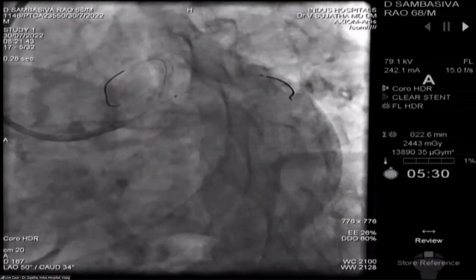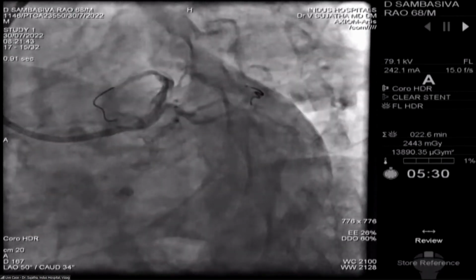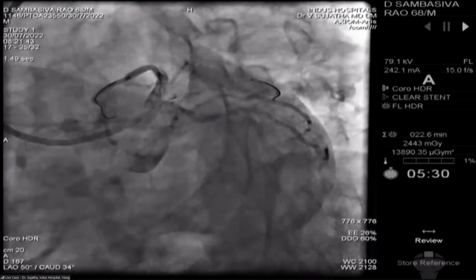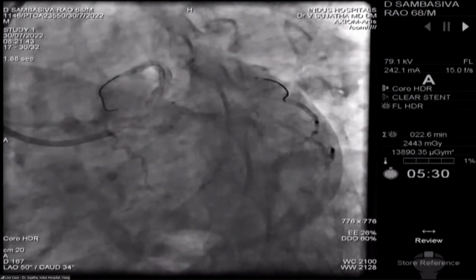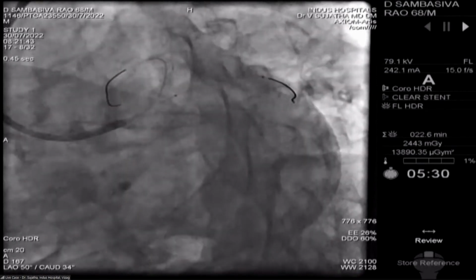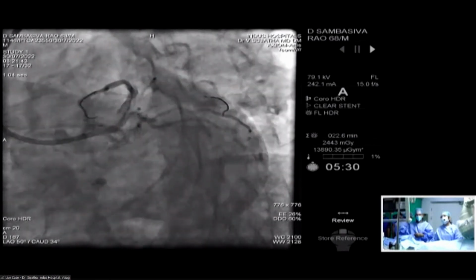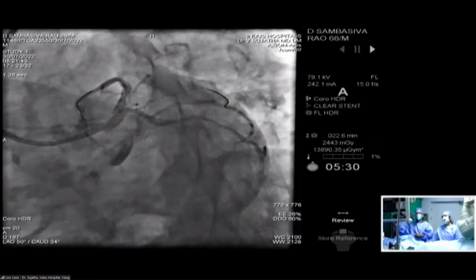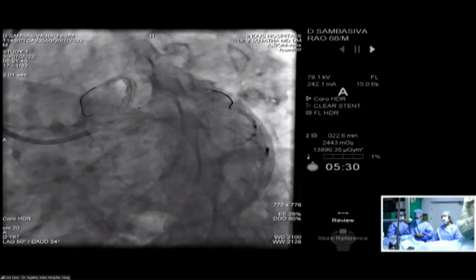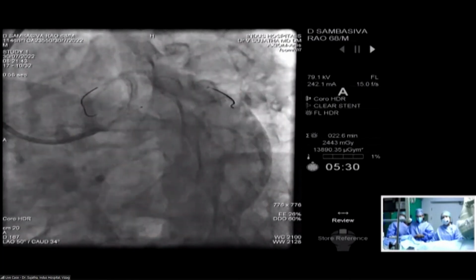Yeah, so here we still see that 3 o'clock where that small diagonal is coming out, I would expect a stent under-expansion to be at that point. So maybe you can take another, maybe larger balloon, or the same Wolverine is also fine, one more time in that region. Sir, you want me to use the 3.3? I have a 3 Wolverine. I went up to 14. It is 3.3. Or you want me to take another 3.5 non-compliant balloon? Yeah, 3.5 non-compliant balloon, madam.